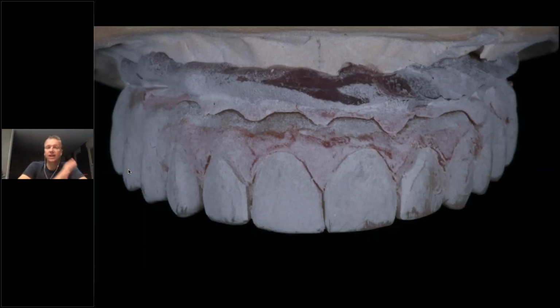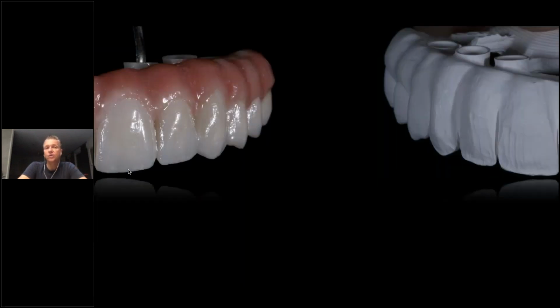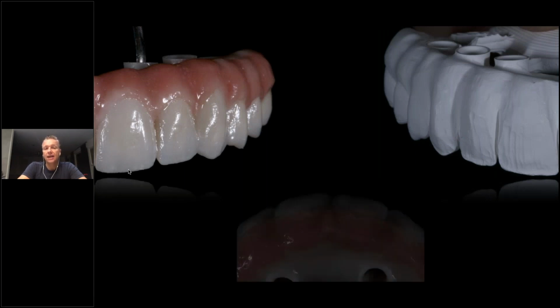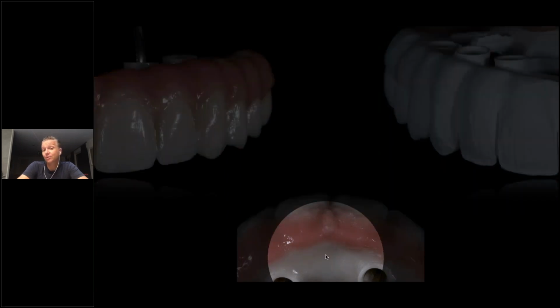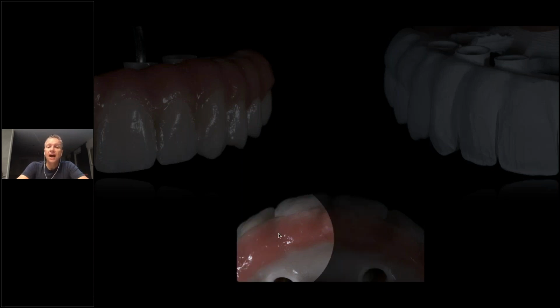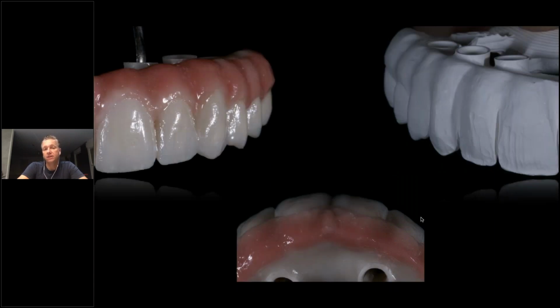I will spray it with scan spray, scan it basically, and be able to mill it in zirconia after I do the changes, and finishing up with a slight cutback with slight porcelain layerings. And as mentioned already, the intaglio surface you see is actually not pink, it's tooth colored. We don't see that. That's the tissue touching, and I just layer basically the pink gingiva on top, very, very minimal. And that's the final patient smile with his REAX bridge.